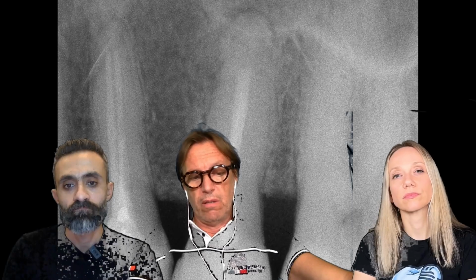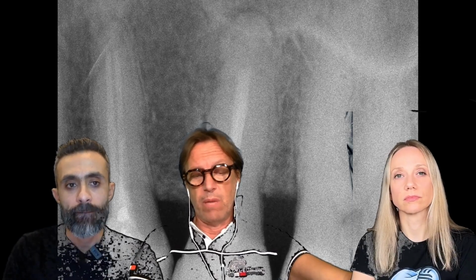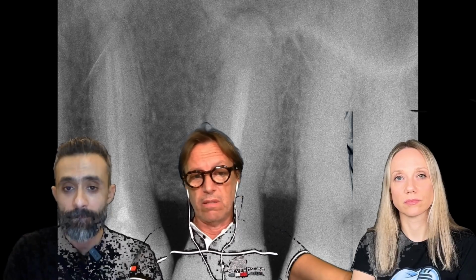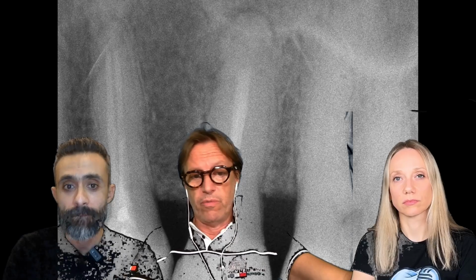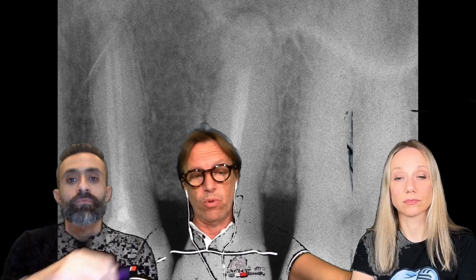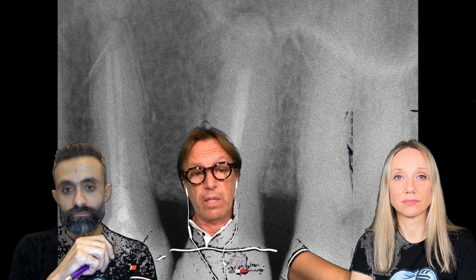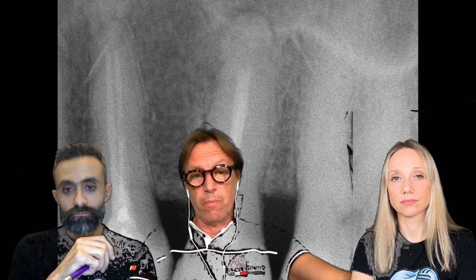The first thing that we have to check is the surgical access, because sometimes it's not possible to do the surgery because we don't have enough access in the back of the mouth, for example. Usually it's possible to reach the first molar without any problems, sometimes the second molar, but not all the time.